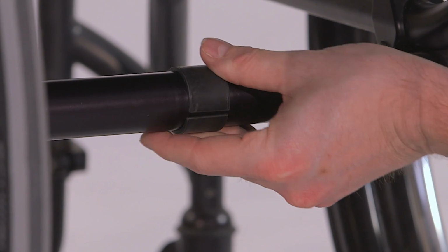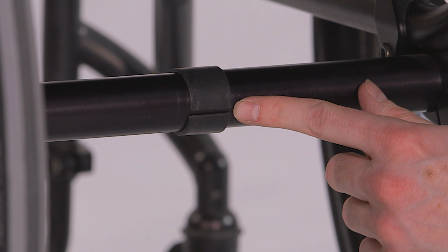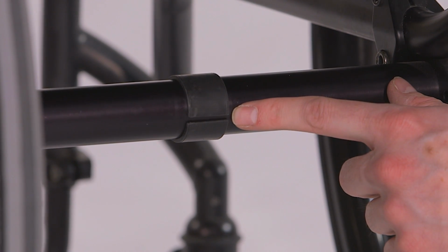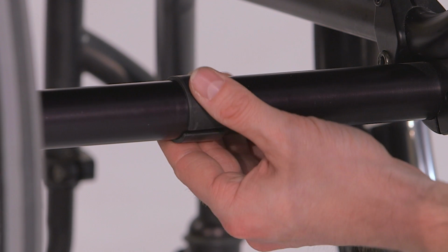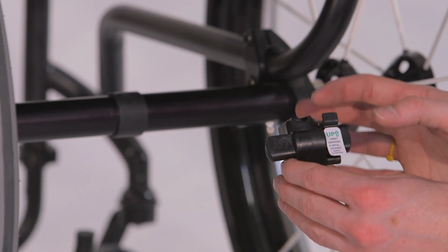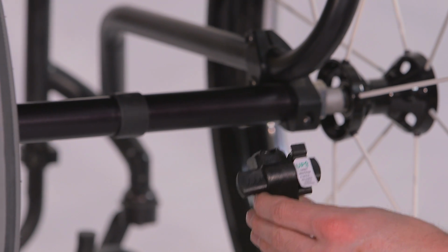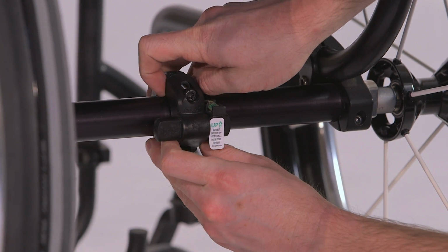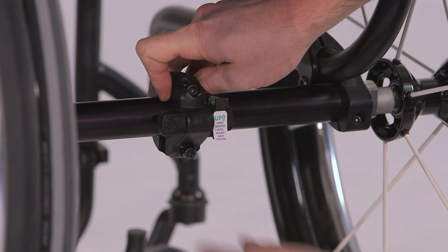When you put the rubber insert on the axle, you want there to be only a small gap between the ends, as shown here. After checking the gap, you'll want to rotate it down so it's toward the ground. Now it's time to install the clamp. Making sure the clamp front isn't upside down by looking at the Max on it, simply position the back and the front over the rubber insert and begin to tighten the 2 screws.